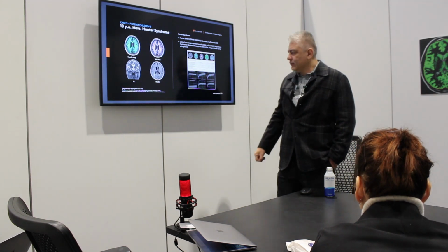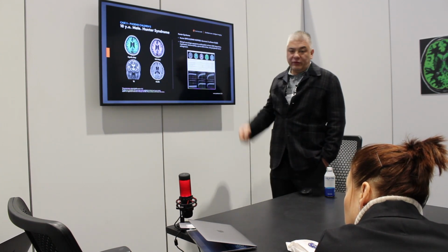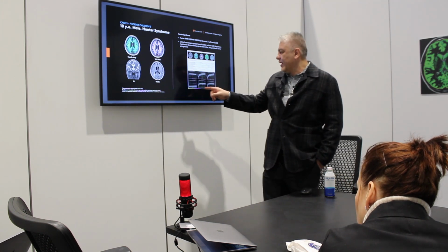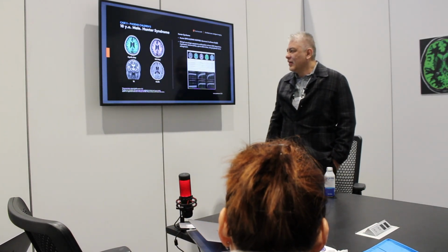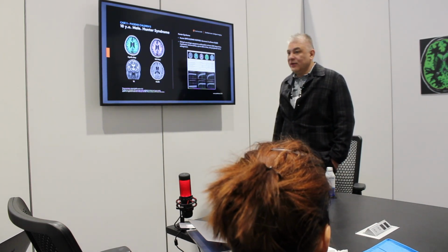So that's the myelin. And what's the first part? That's the brain parenchymal fraction, the brain volume. So yes, of course there is volume loss. There is volume loss, there is increased cerebrospinal fluid, but significant decrease in myelin. So that volume loss is dependent on a significant decrease in myelin, and also loss in volume.